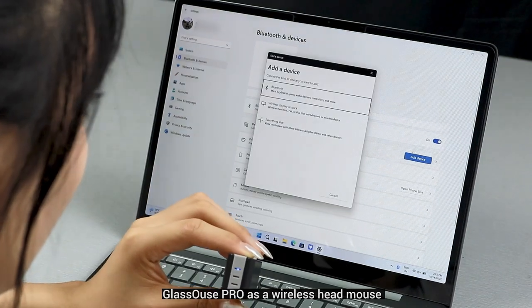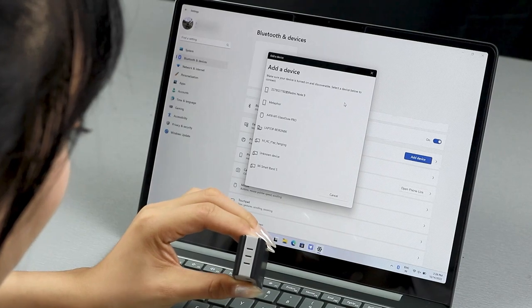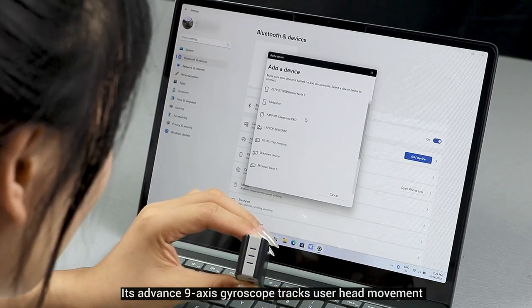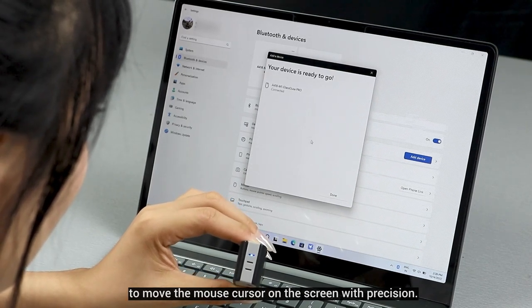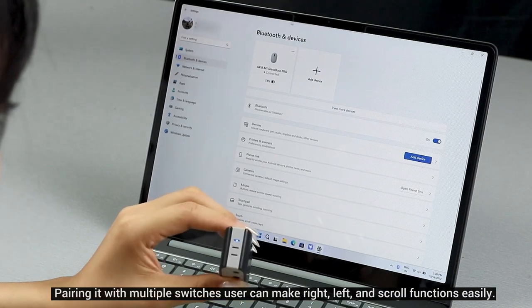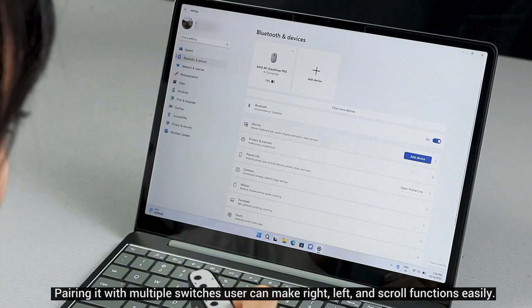GlassOuse PRO as a wireless head mouse allows the user to control their devices by moving their head. Its advanced 9-axis gyroscope tracks user head movement to move the mouse cursor on the screen with precision. Pairing it with multiple switches, the user can perform right-click, left-click, and scroll functions easily.